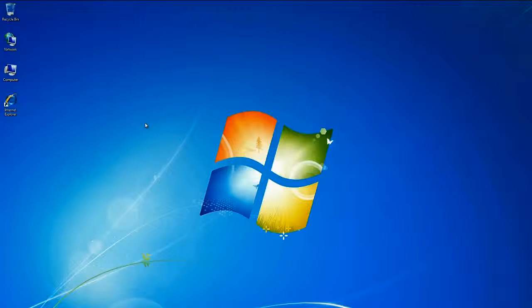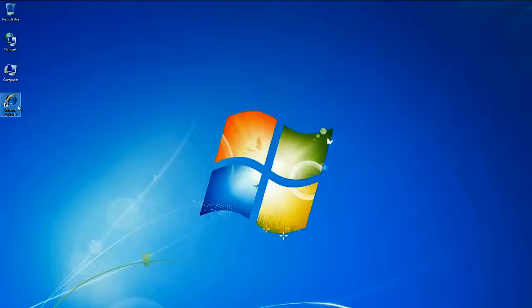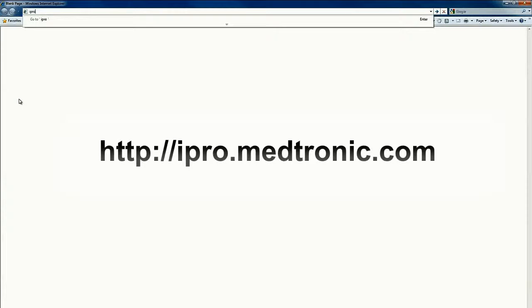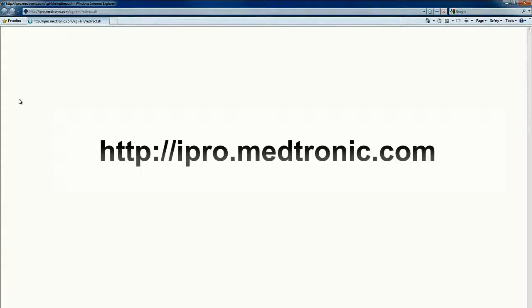CareLink iPro is compatible with Windows XP, Vista, and Windows 7, as shown here. To sign in to CareLink iPro, go to http://ipro.medtronic.com.